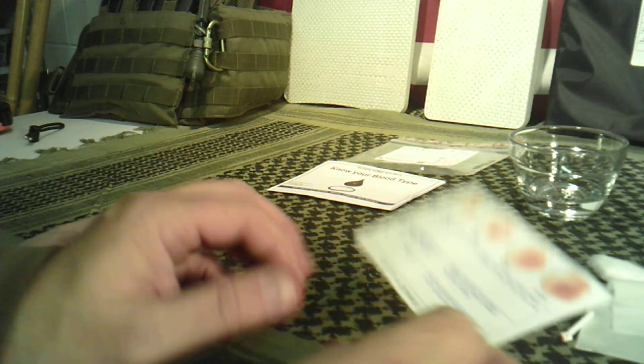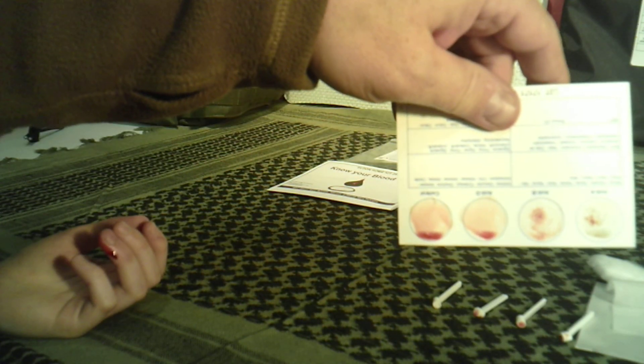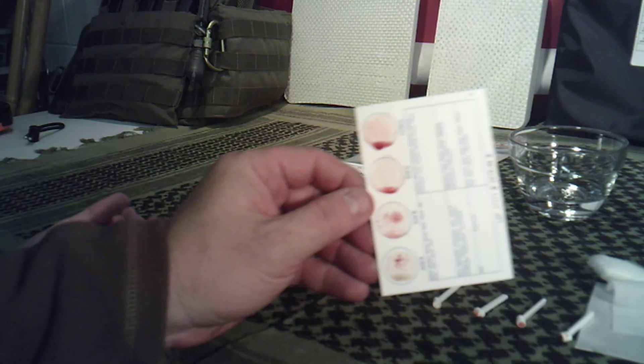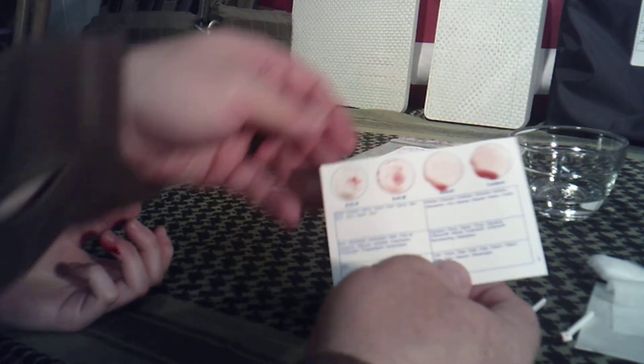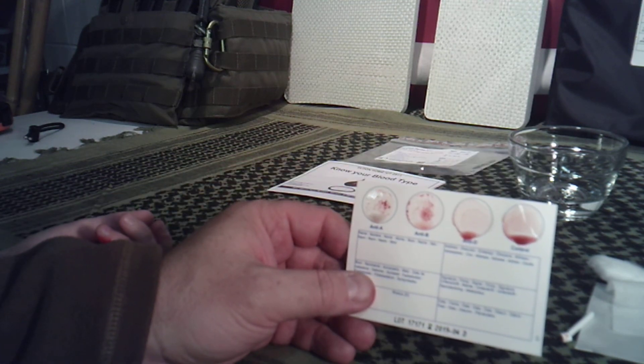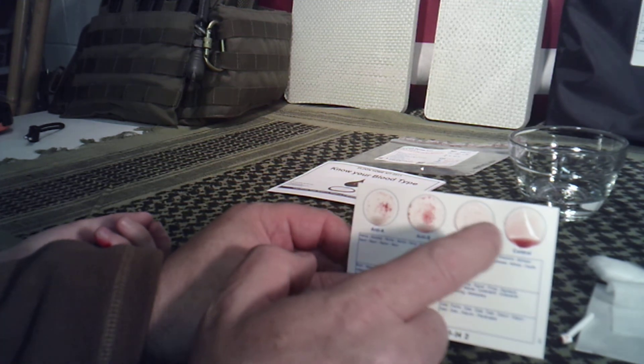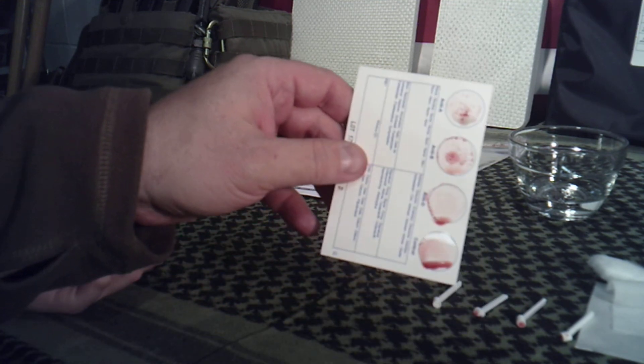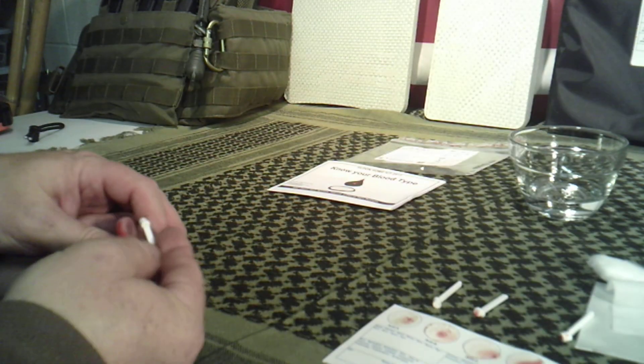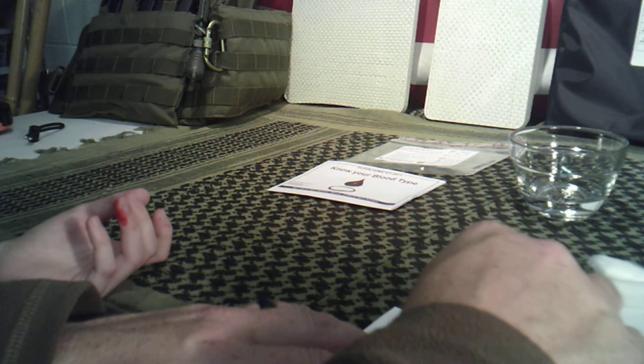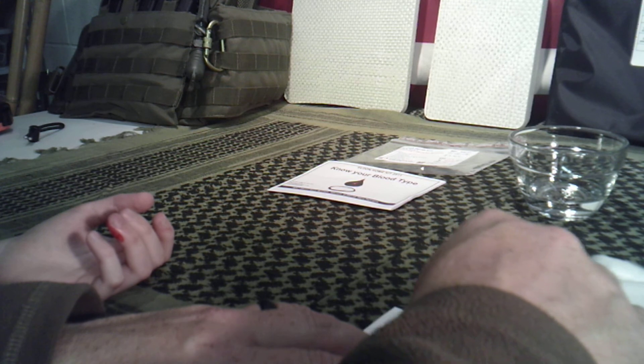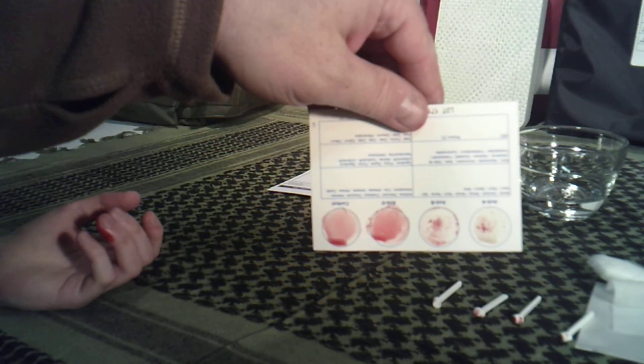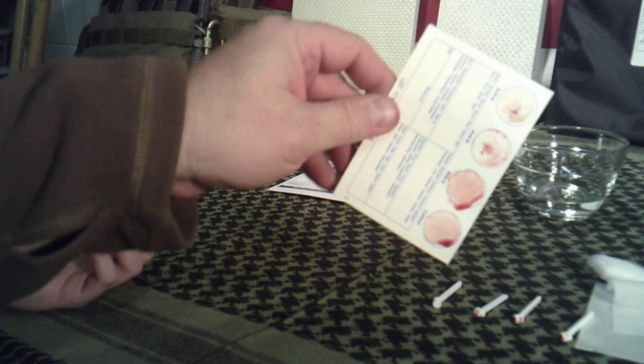Alright, so once you get them all like that, pick it up and start turning it for a few seconds down this way. And then turn it sideways, like that. Roll it around. Alright, so you're already seeing some coagulation here and here. None here and there, so we're starting to get results already. This one is actually doing it a little bit. I can go back and I might can even put a little more blood here, kind of go around with it again, just to make sure. This one is starting to clear.